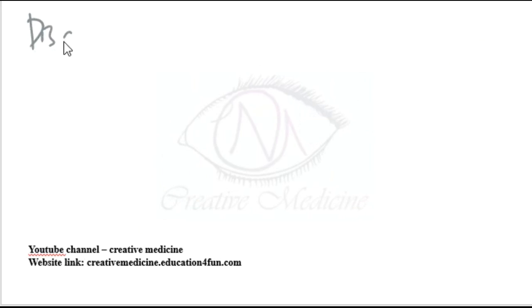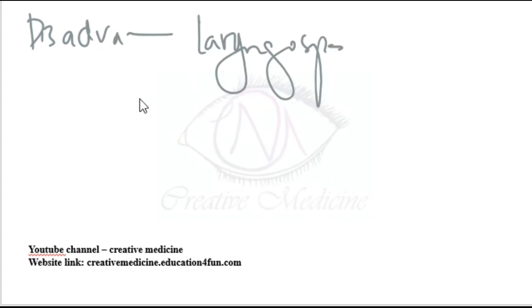Disadvantages of laryngeal mask airway. Laryngeal mask airway can result in laryngospasm and aspiration.